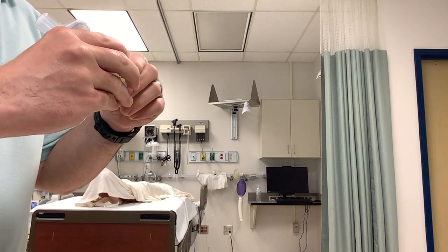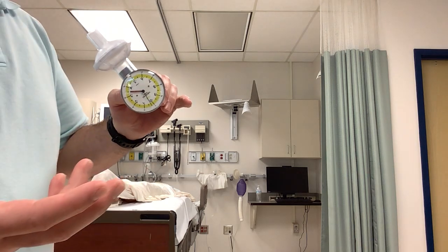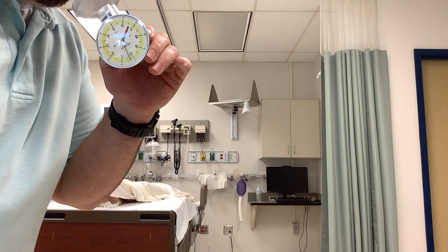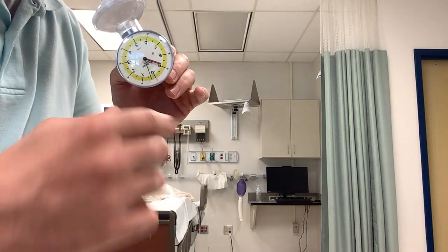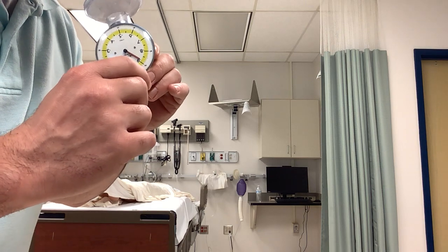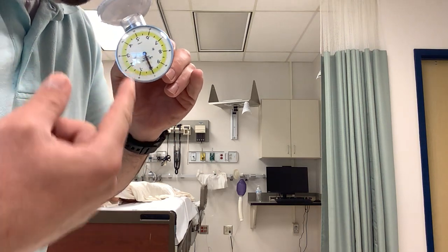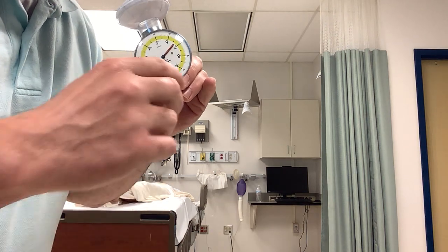There are a couple of different ways you can do this if you're going to assess someone's minute ventilation, and this is what you're going to do for your procedure competency evaluation. For the minute ventilation, you're going to have the patient place the mouthpiece in their mouth, let them get acclimated, and then when you're ready to start your minute, you can do one of a couple of things. This button on the bottom, if I breathe in and I'm ready to get started, all right, so start, go, I can click that to 0, and then as I'm breathing, it'll continue to change.